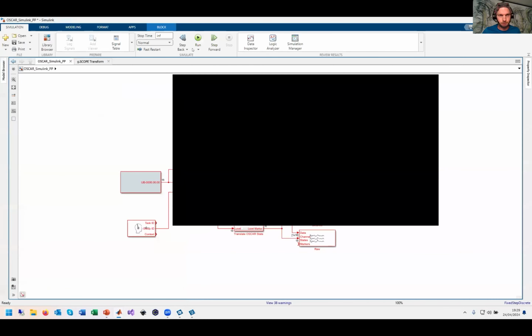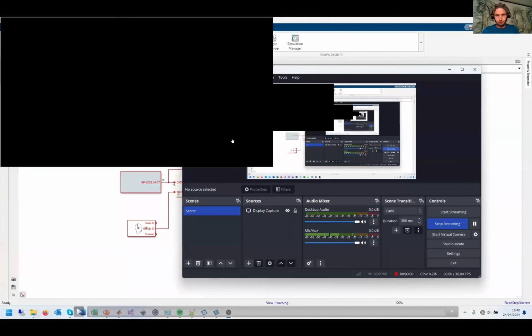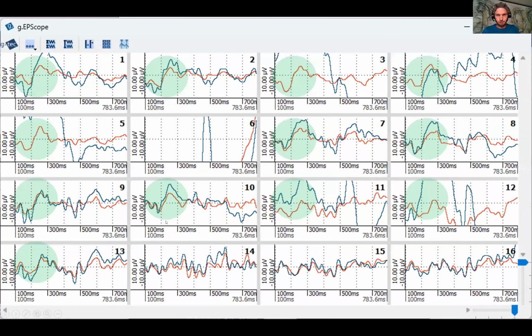Yeah, I'll close that now. So that's enough about real-time demo. So here in this experiment, right before the talk today, I did the very same. And what was very nice to see was that even though we are really operating in a very narrow time scale, we are producing very fast results. The response here is quite consistent.